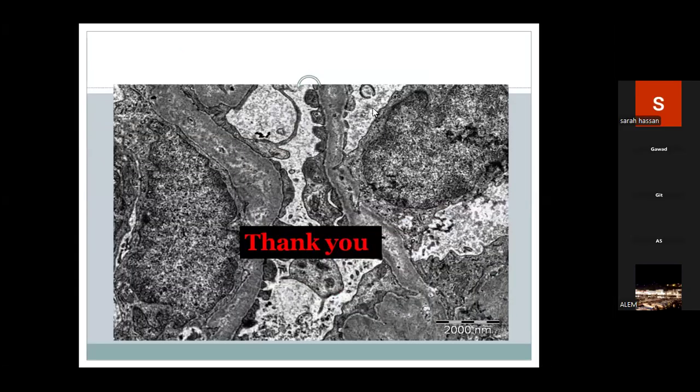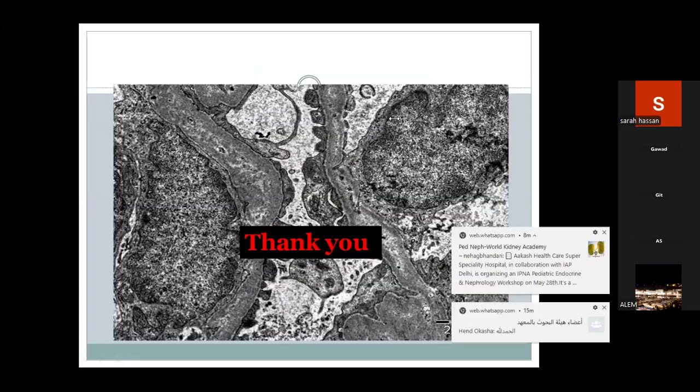And I want to highlight more the importance of staining for C4d in the biopsy, especially in cases with membranoproliferative glomerulonephritis, because I think in my little experience in this area, in some rare cases, patients who have monoclonal gammopathy associated with MPGN may present with isolated C3 deposits with no staining of immunoglobulin. I think this is called masked deposits.